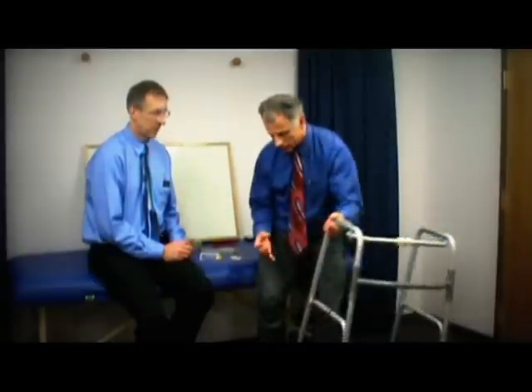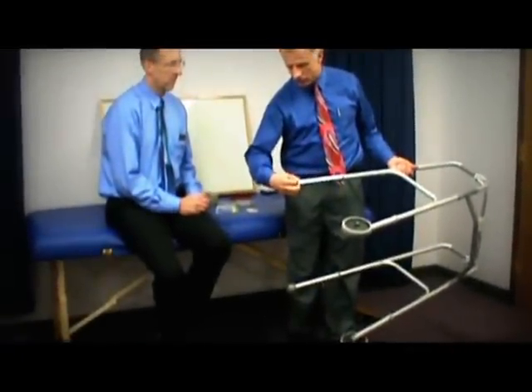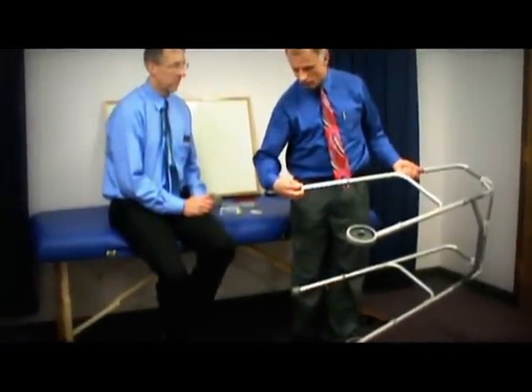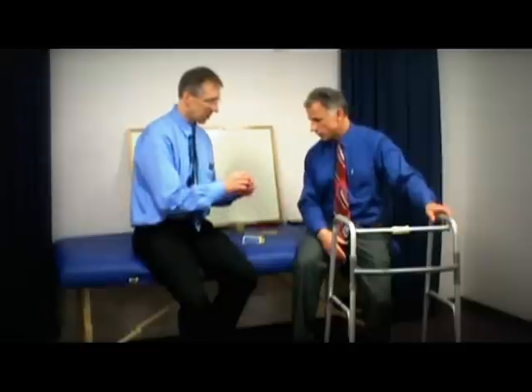A real popular thing in the past has been to get a tennis ball, cut it open with a slit, and put it on the walker leg, and it stays on because you only cut part of it open. We have a video on this as well. But Bob has found something better than a tennis ball. I have to give credit to one of the girls who works with us, Julie Gibbs. She came up with this. These are little felt protectors that you put on the bottom of chairs so that they don't damage your floor.